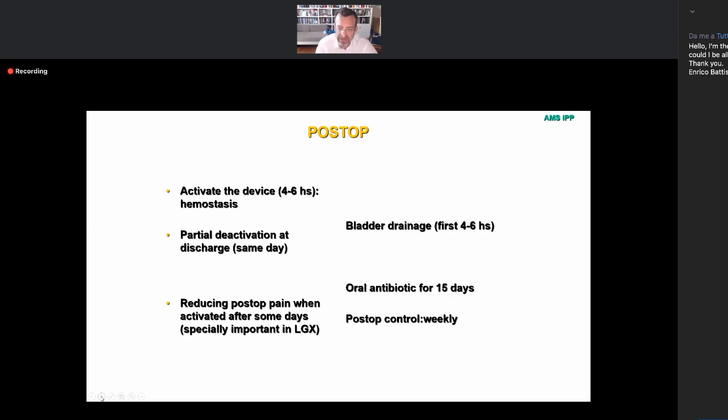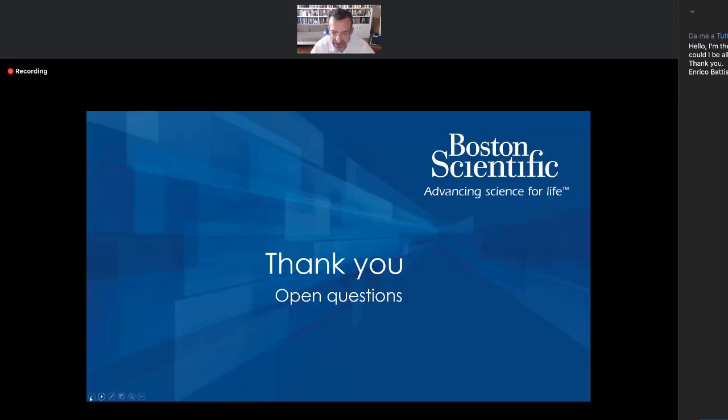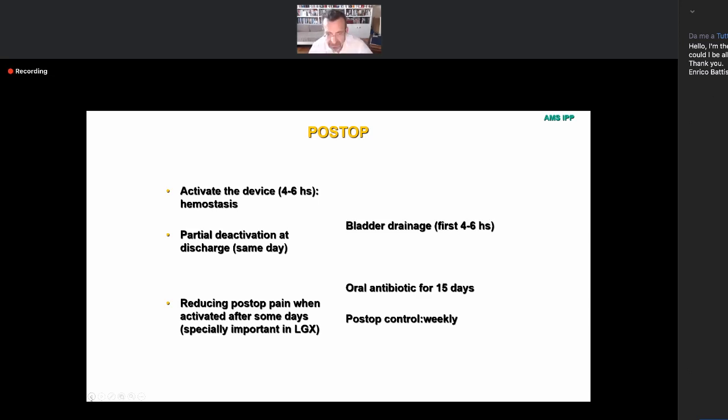I advise the patients not to start using the prosthesis before 6 weeks. And these are my last messages. This is a very nice surgery. Please do it, because in my opinion, it is probably the best treatment for erectile dysfunction most of the time.